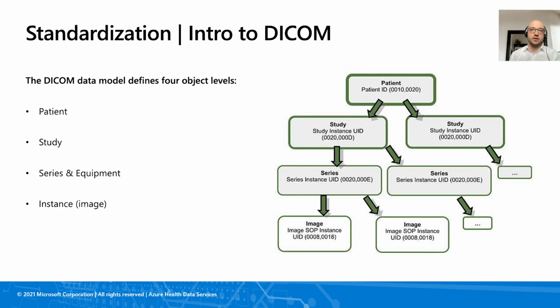You can have as few as one image in a series, or you can have 50 or 100 images, depending on the resolution and slicing of the scanning that has been performed on you. That number may change. And the other thing I would like to bring up is that as the number of images in a series increases, that will definitely increase the size of your study on a given patient.